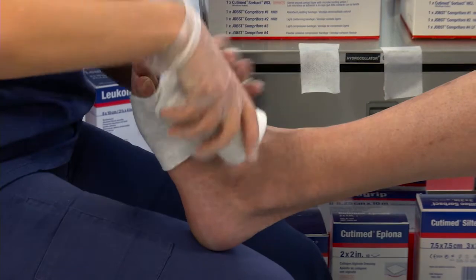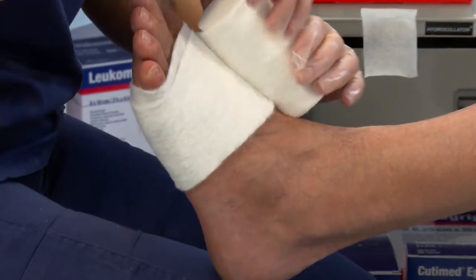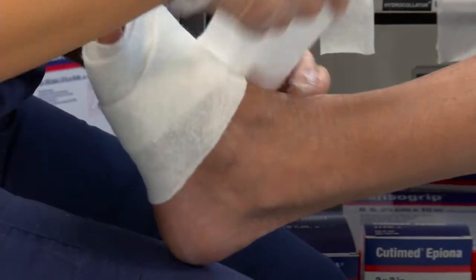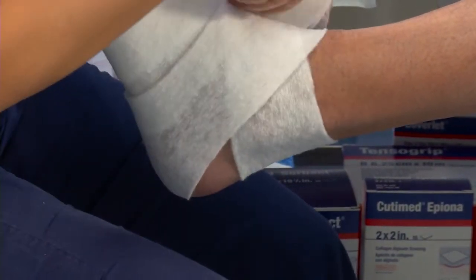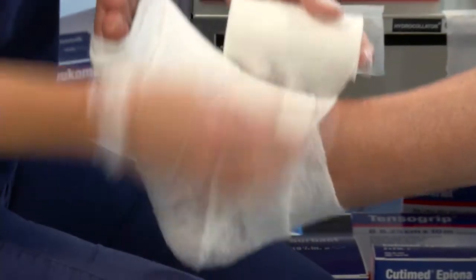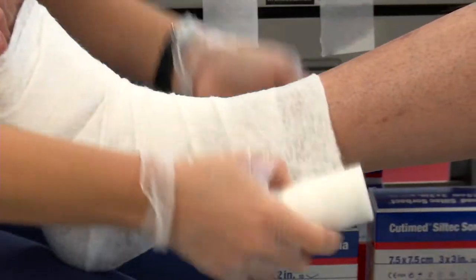This doesn't provide any compression, but you want to make sure that you apply enough tension that it lies evenly against the patient's skin. When we get to the ankle, we're going to do a figure of eight and come back and make sure that we capture the heel. Then we're going to spiral up the leg in a 50% overlap.